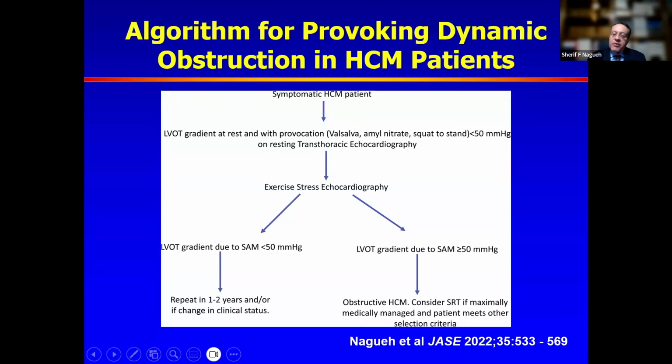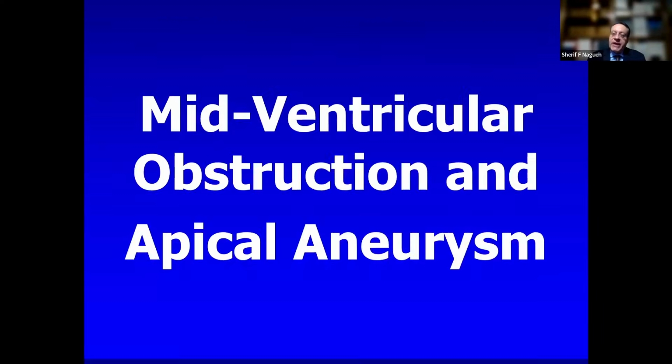As you know, the dynamic gradients vary with time, vary with activity, vary with intravascular status, vary with blood pressure. Even a postprandial situation can make the gradients worse. So these factors should be taken into account. And if needed, you can repeat the exam.